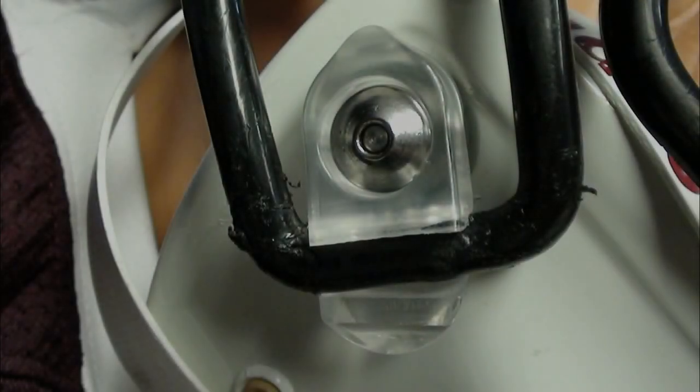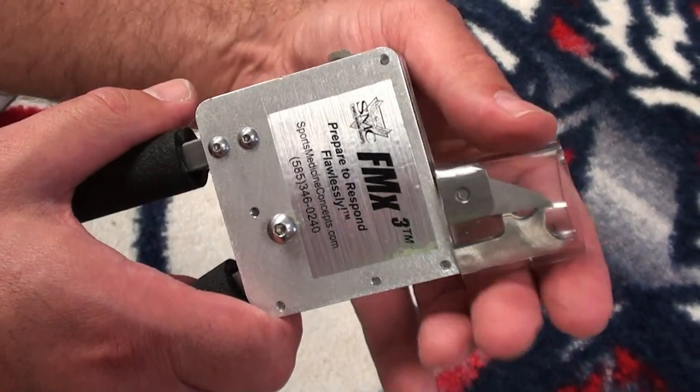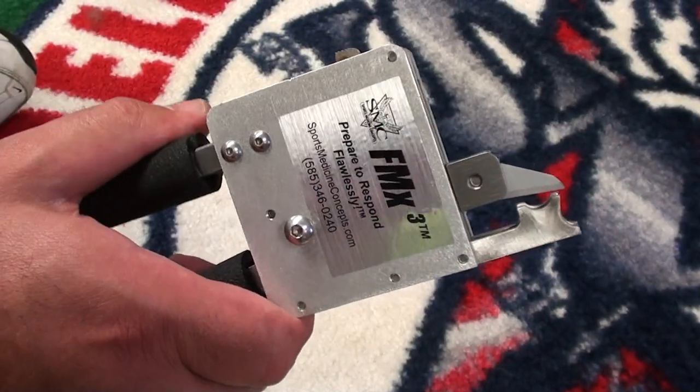In the event that attempts to remove the fastener using the quick-release system are unsuccessful, reposition the FM Extractor and prepare to cut the fastener from the helmet. Begin by removing the protective safety blade cover from the FM Extractor.